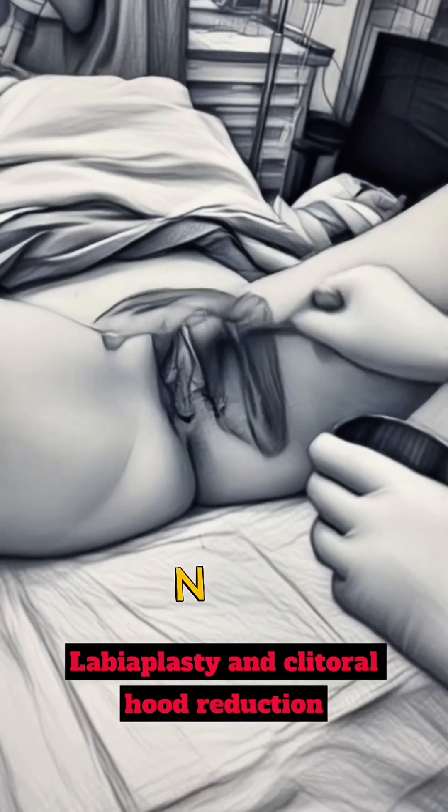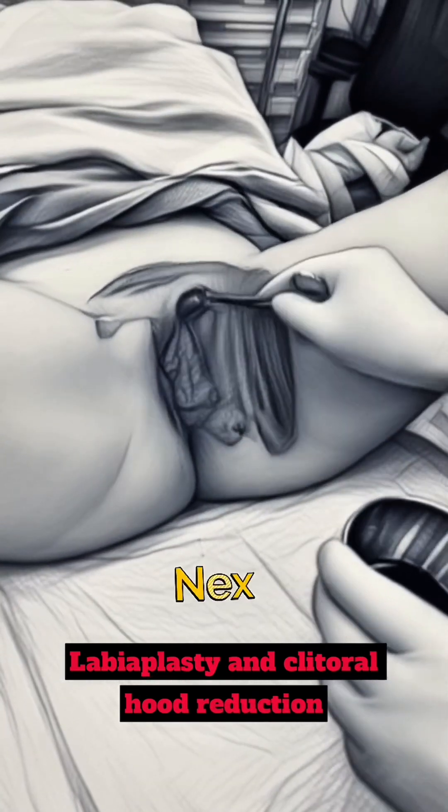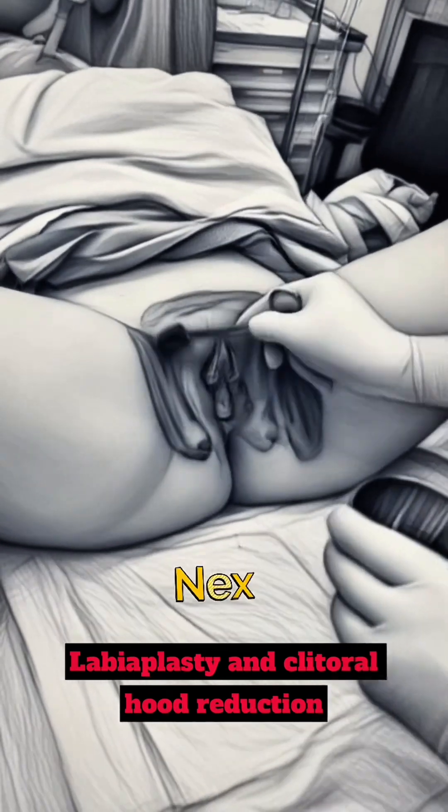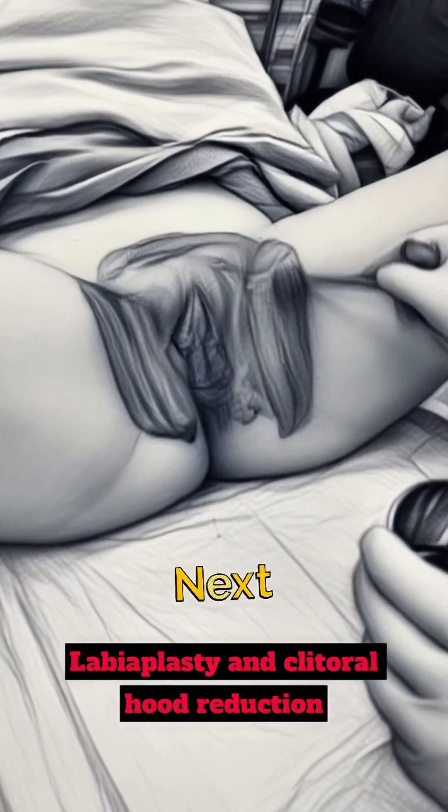This particular labiaplasty is being done asleep. Typically, we do them awake. In this particular case, we're combining this with breast surgery, so that's why she's asleep. Otherwise, this could have been done with her fully awake.